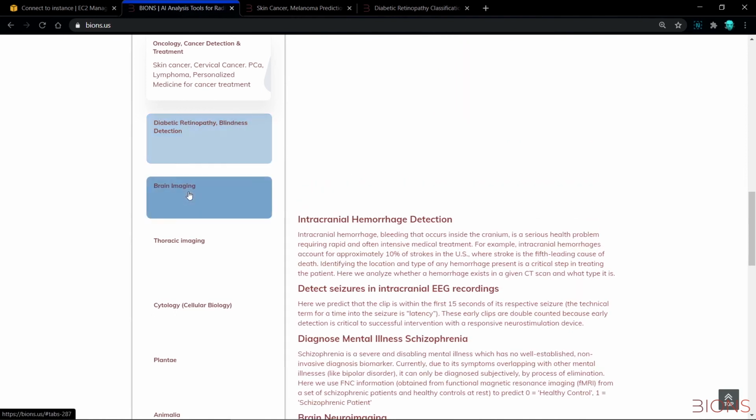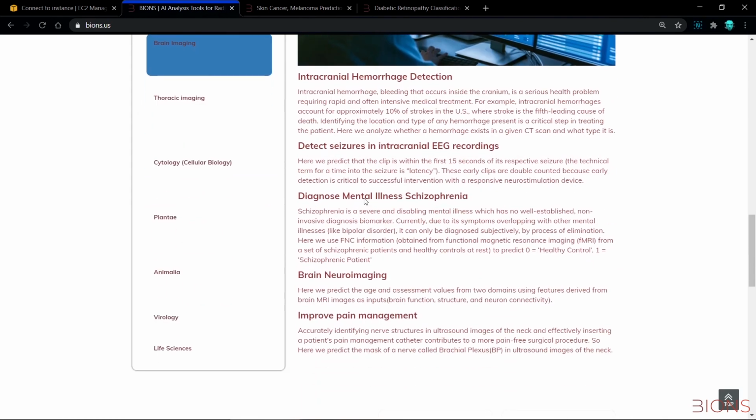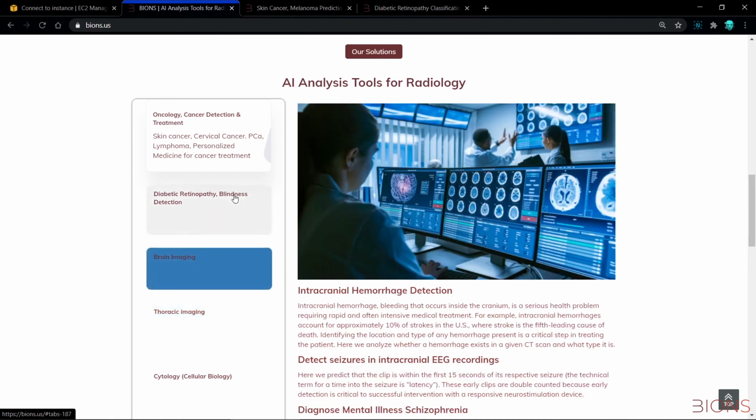Now we will mostly go for intracranial hemorrhage detection, mostly with CT scans. CT scans will also cover the thoracic region, that's pulmonary embolism detection and chest CT scans. Currently we are not going for X-rays because X-rays contain just one or two images that can easily be identified by some radiologists, but CT scans contain hundreds of images, in the factor of 64.